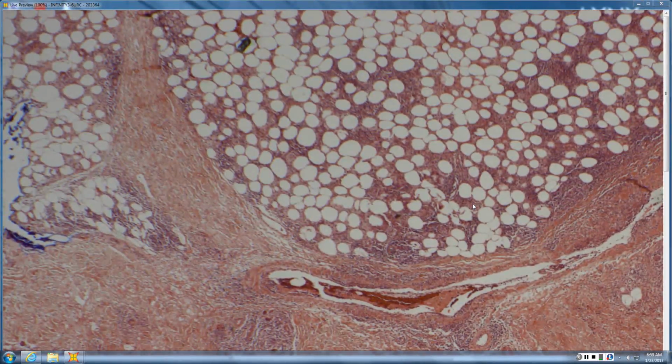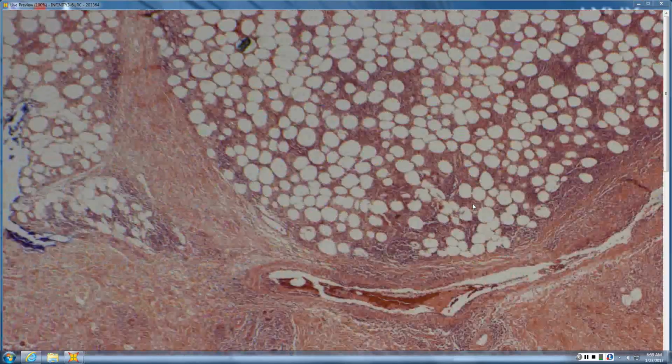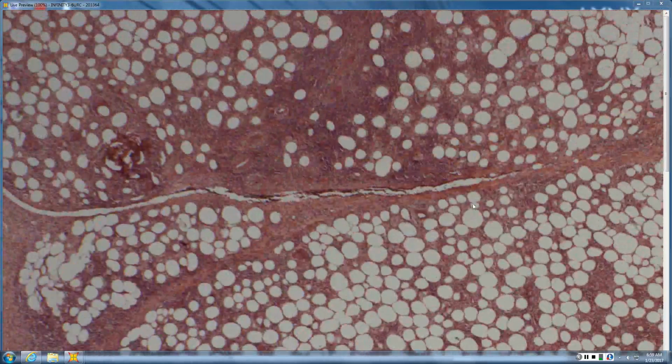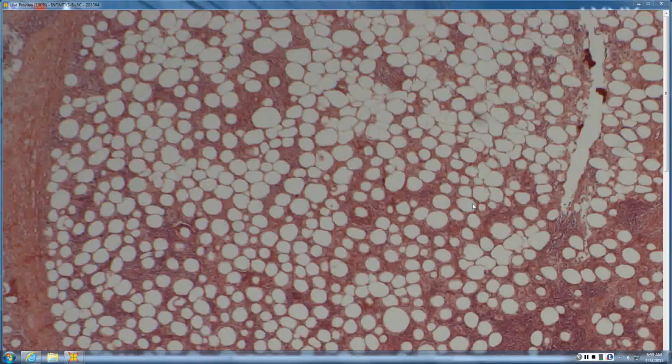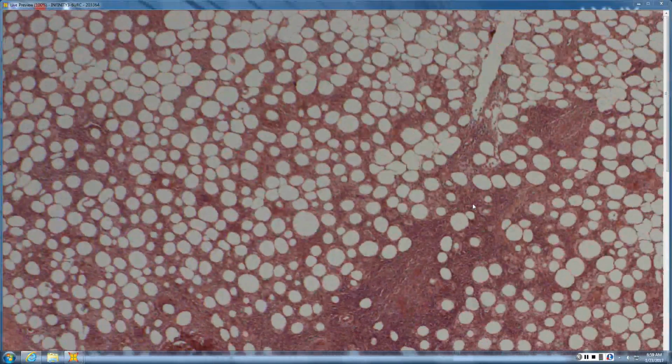And then, to me, there's some thickening around these blood vessels. Like those blood vessel walls are really pretty thick through here. Let's go back to scan. So, your branch point, okay, is this septal primarily? Is this lobular primarily? So this one is primarily lobular, right? This one is pretty clean cut in terms of where the inflammation is, which is helpful.